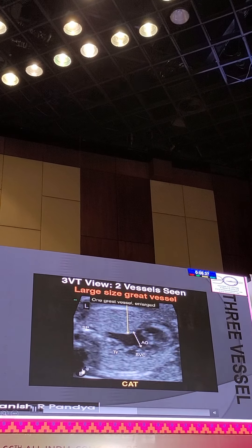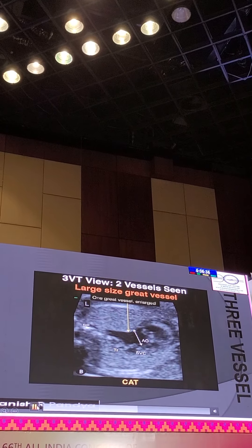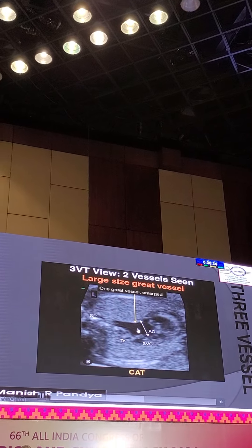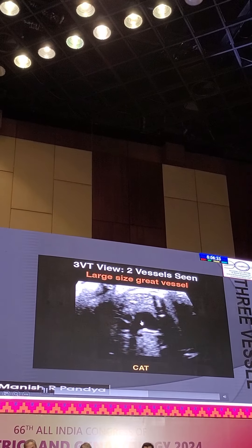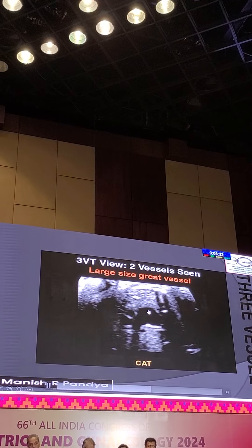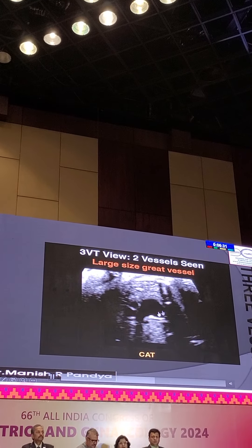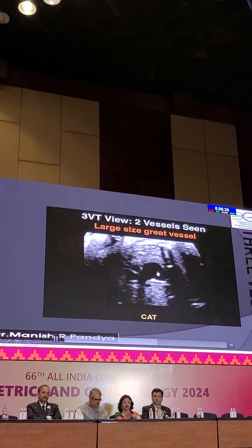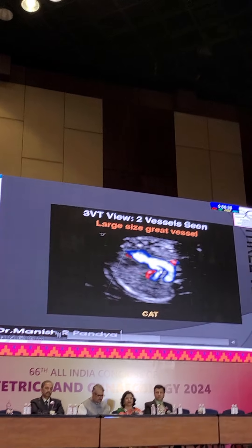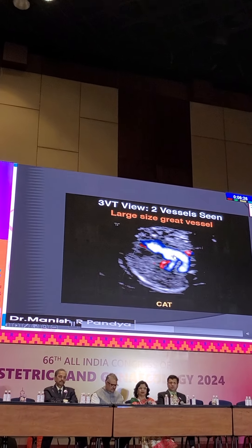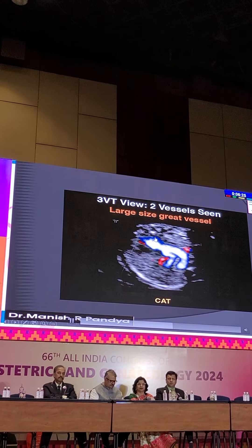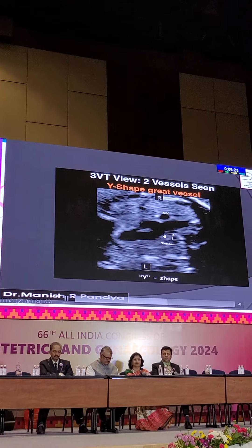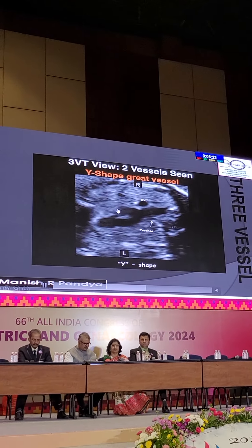If you see a single dilated vessel, this is a common arterial trunk. Rather than three vessels, you can see one dilated vessel — it is a case of common arterial trunk, and it is very well seen in the three-vessel tracheal view. On color, you can see two vessels flowing from the common arterial trunk.